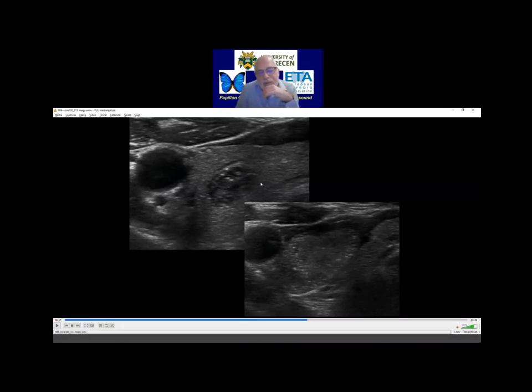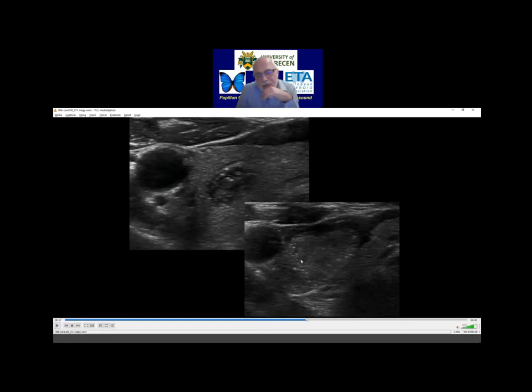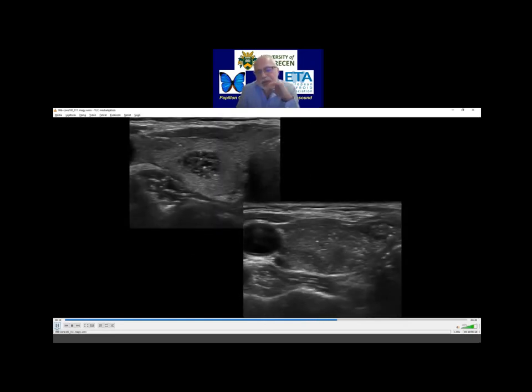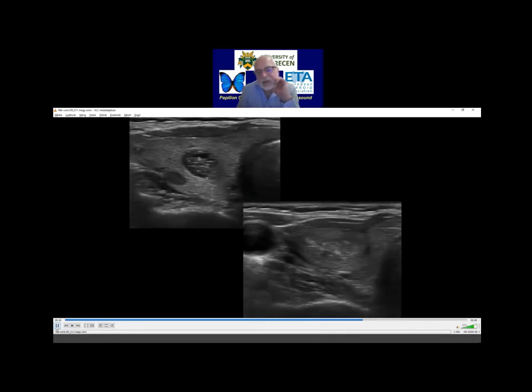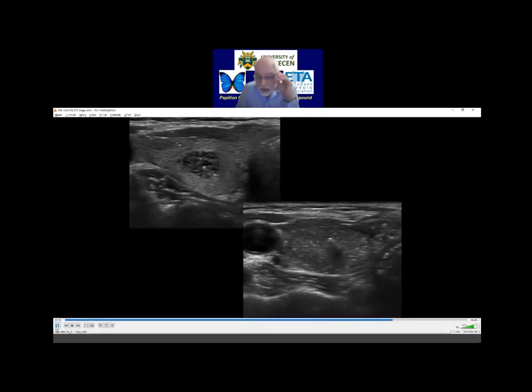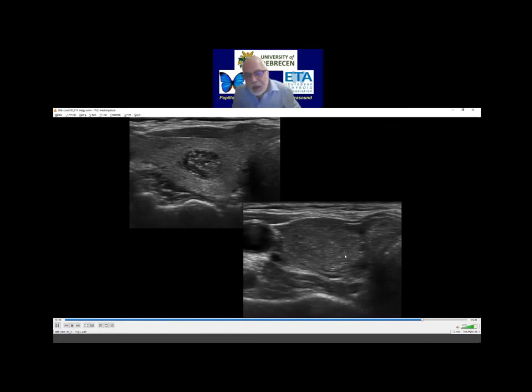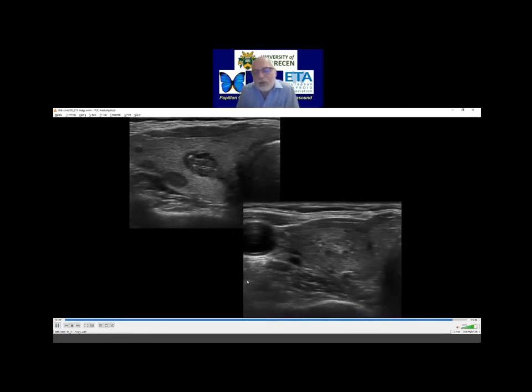If we compare this benign lesion — this patient underwent surgery — it proved to be a hyperplastic nodule, while the larger nodule proved to be a papillary cancer. And these figures in the larger nodule should be interpreted as microcalcifications, because histopathology disclosed that this large nodule contained numerous microcalcifications.